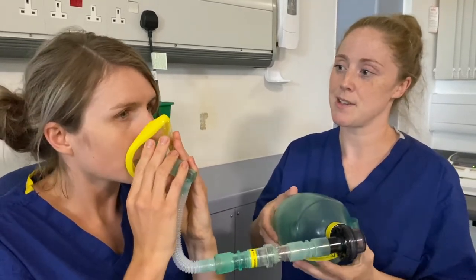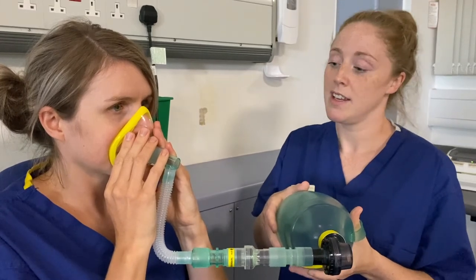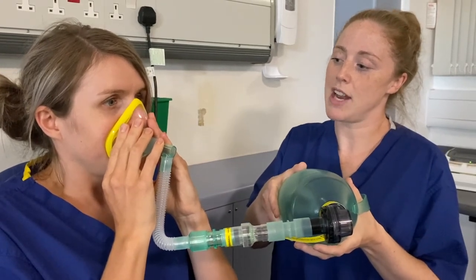So Katie, can you place the mask on your face? After I ask Katie to take a breath in, I'm going to squeeze the bag to supplement her breath. Take a breath in for me, Katie. And again, one more. And if you take the mask off and have a good cough.